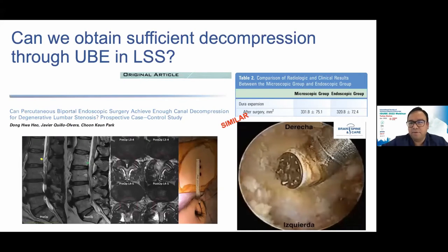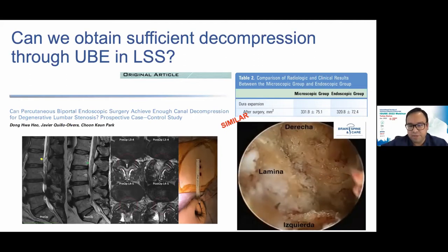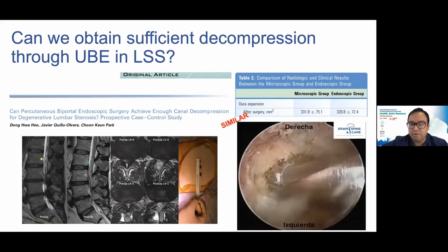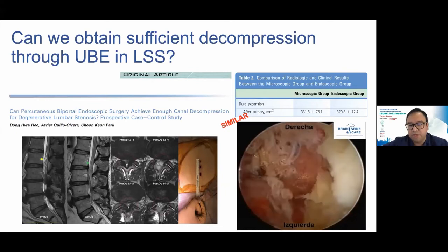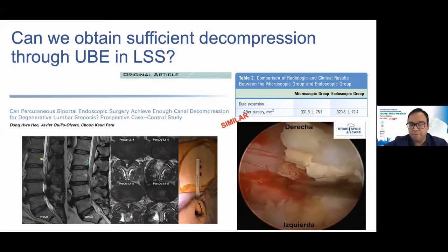So we can obtain sufficient decompression through biportal endoscopy in lumbar spinal stenosis. We have a lot of evidence in the literature. We published an article on that topic, and we found that we can reach an expansion of the dural sac after biportal surgery similar to microscopic surgery. The surgeon can directly observe the neural elements and decompress the central part of the spinal canal, and also address the lateral aspects of the spine. So we can also decompress the subarticular area, or if the case requires, the foraminal area with different approaches.